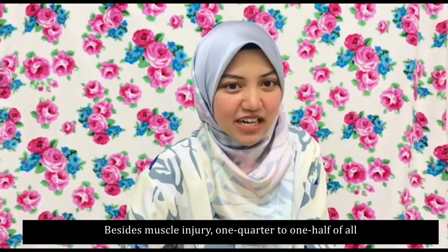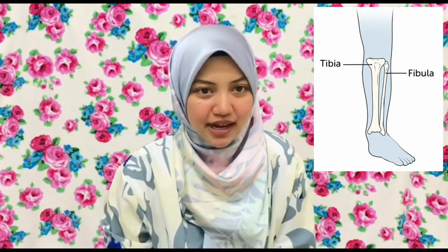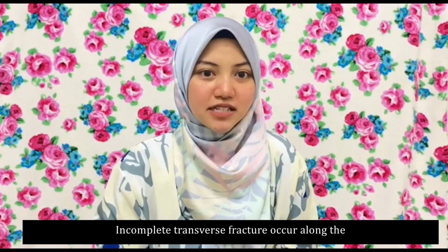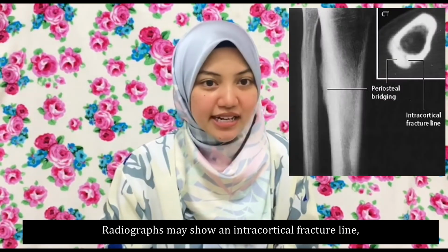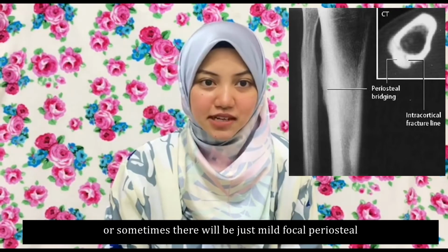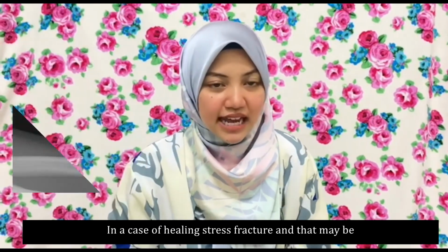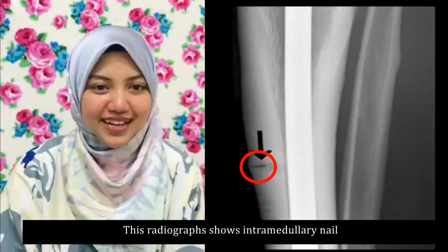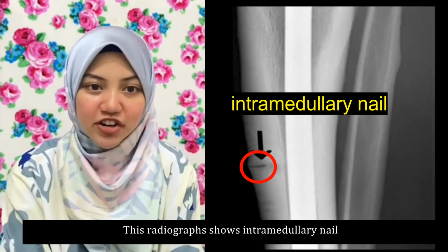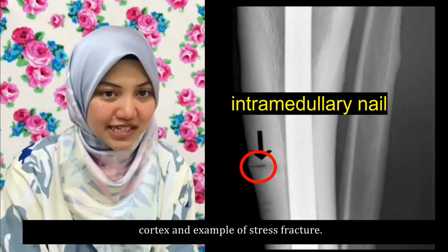Besides muscle injury, 1/4 to 1/2 of all sport-related stress fractures occur in the tibia. Incomplete transverse fractures occur along the anterior or posterior tibial cortex. Radiograph may show an intracortical fracture line, or sometimes there will be just mild focal periosteal reaction representing immature callus. In the case of a healing stress fracture, that may be the only abnormality visible on radiograph. This radiograph shows an intramedullary nail and an incomplete transverse line along the anterior tibial cortex, an example of stress fracture.